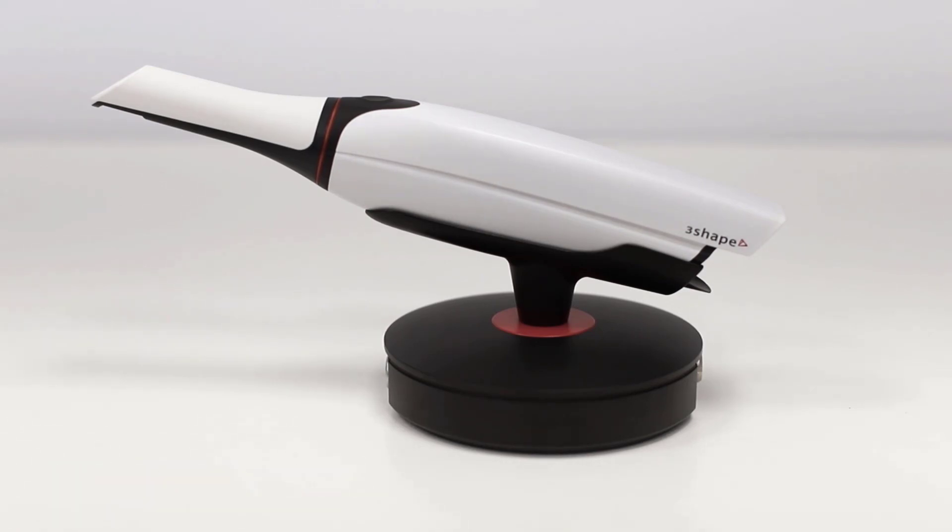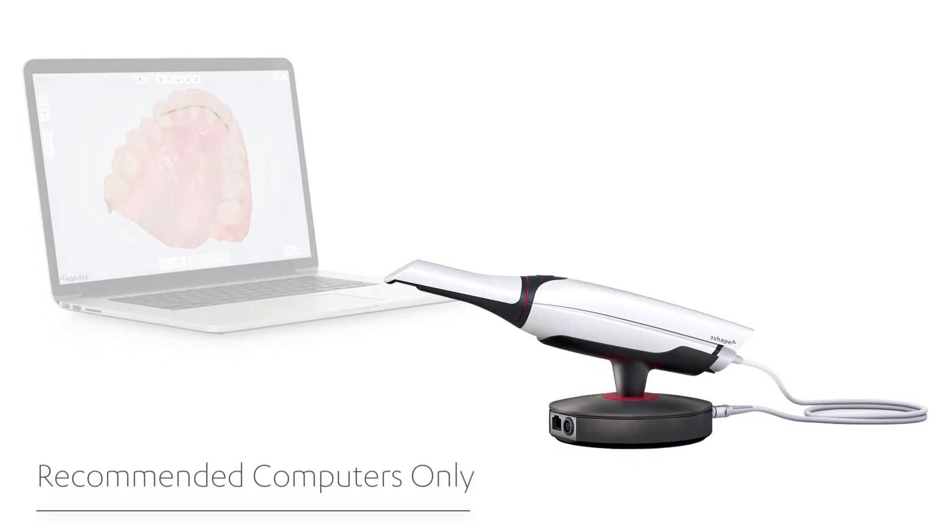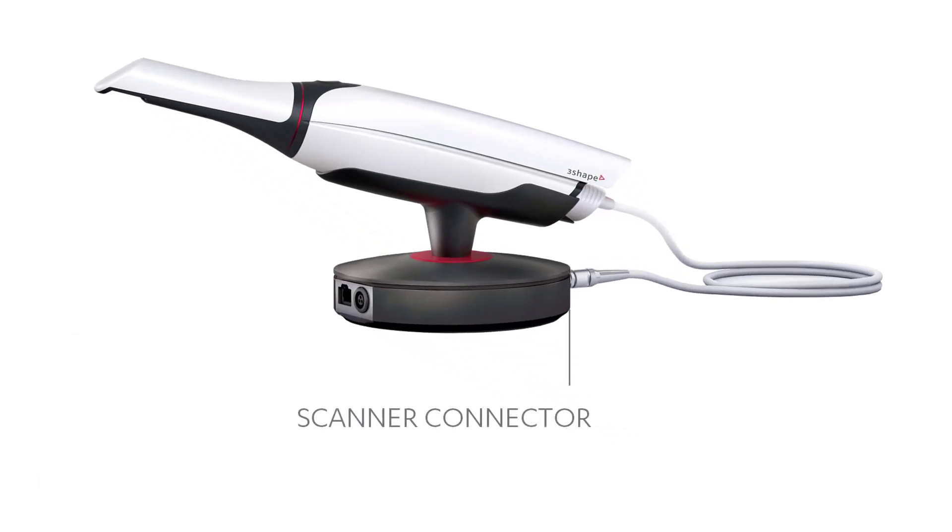It is available as a pen grip. 3Shape will only support TRIOS used on approved PCs. It has connections for the TRIOS scanner, an Ethernet port, and a power plug.